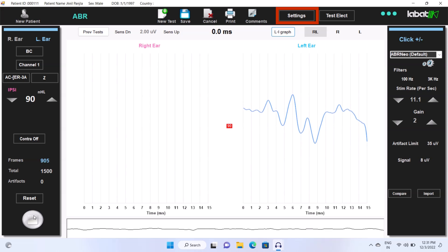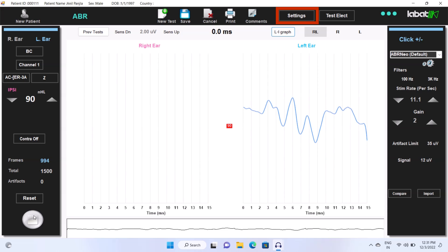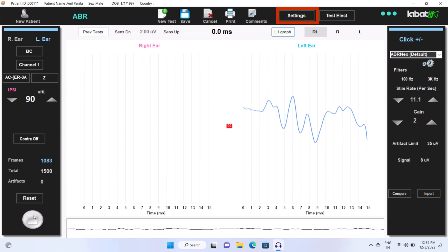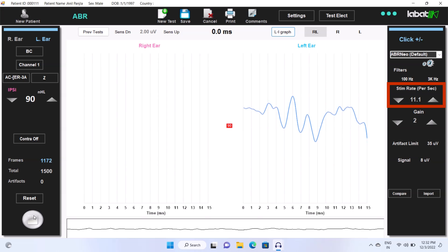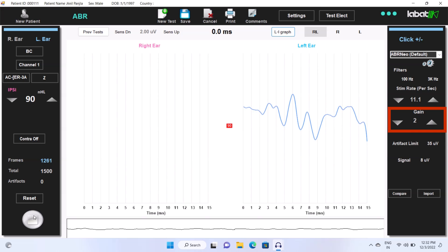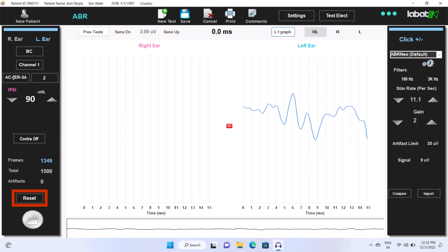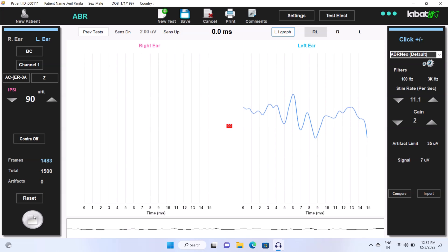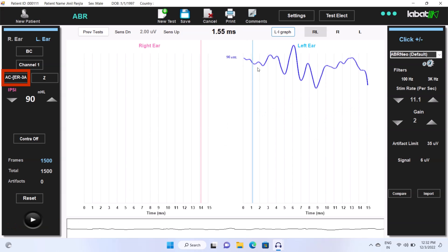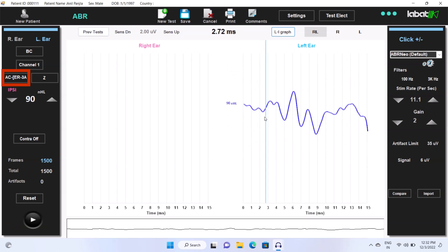Setting is used to select or change different type of filters, frequencies, and automatic marking of traces. You can also change stim rate, gain, and artifact limits. Reset is used to restart new trace again. Make sure you select the same insert which you are using.